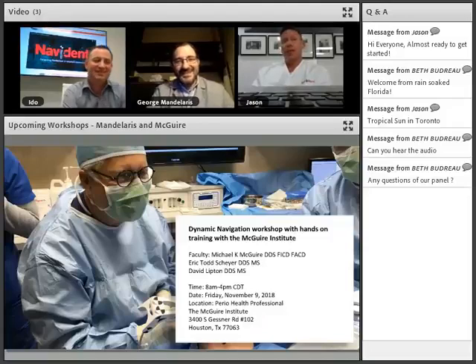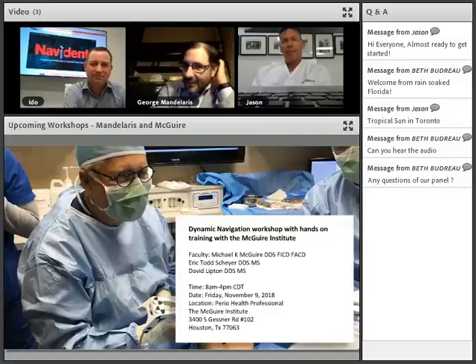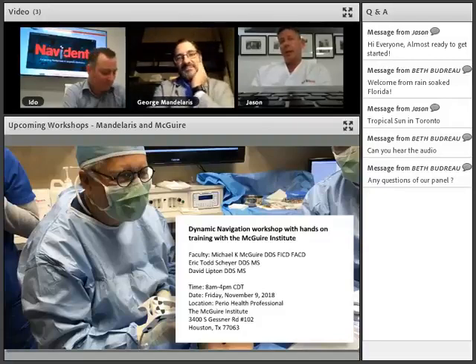You can do 4, you can do 5, you can do 6, but you can do 3, because what we determined, Arish, our main developer, has been doing a lot of testing with the old stent and fiducial versus the new trace registration. When we do 3 points in trace registration, our accuracy is 0.4 millimeters, which is basically the limit of the camera, the limit of the system.